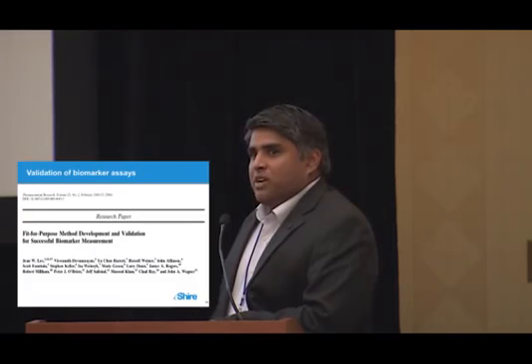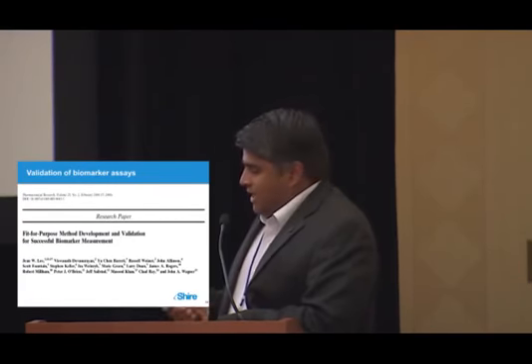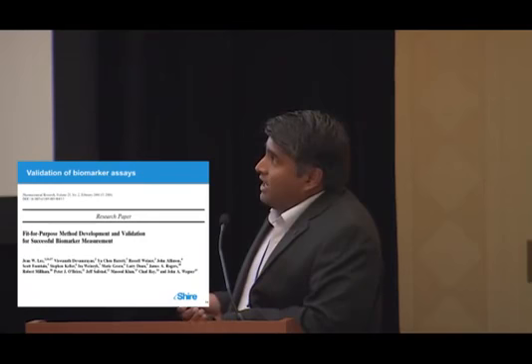And we went back to the drawing board and looked for various antibodies that are out there, and we picked 12 commercial antibodies. Another thing I want to point out is that in pharmaceutical companies, you don't have ample time to search through everything available, so you have a specific amount of time, and we want to make sure that we have an assay that is working for us. So we tested 12 commercial antibodies for RANKL, both in ELISA and in SIMOA platforms. And the criteria for selection were low background and dose response.